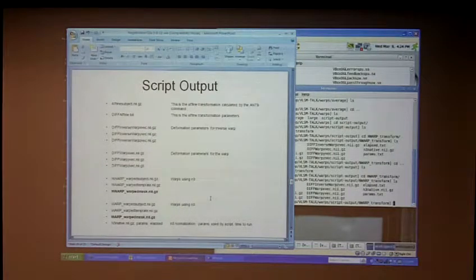Not often, but... Okay, so never mind then. I thought that. So affine transformation, all the transformations take place via this. Yes, this is all that manipulation. Exactly.